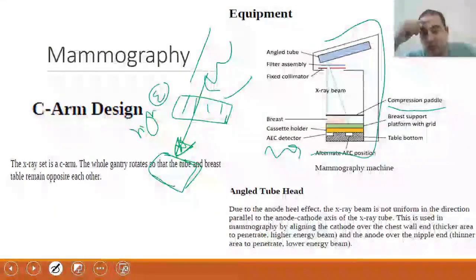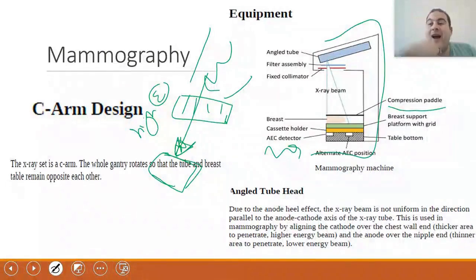They circumvent this problem by using something called an ionization chamber, which is a device used to measure radiation. They use it before and after exposure, meaning it measures what? It measures the ratio between the primary beam that fell and the radiation that reached the ionization chamber located below.